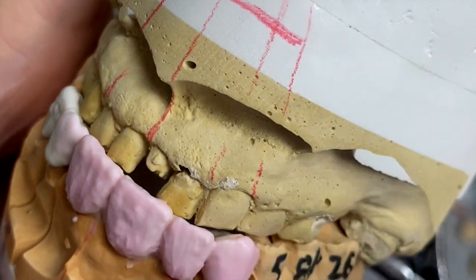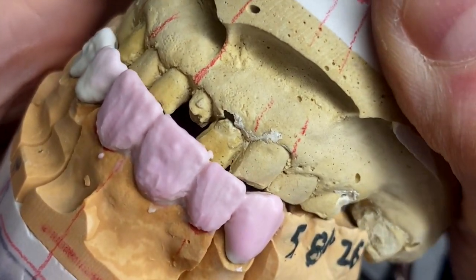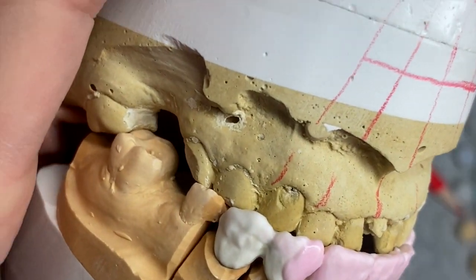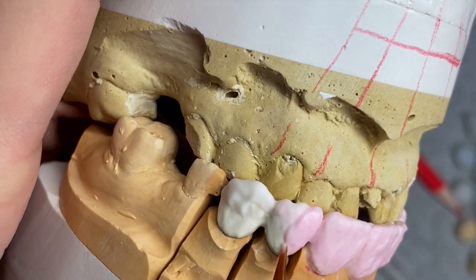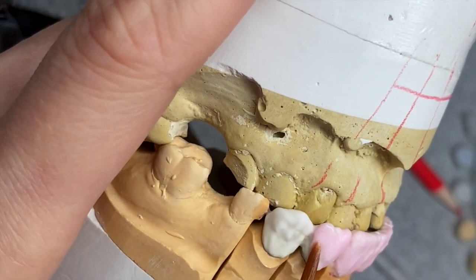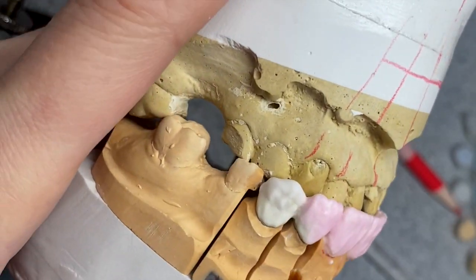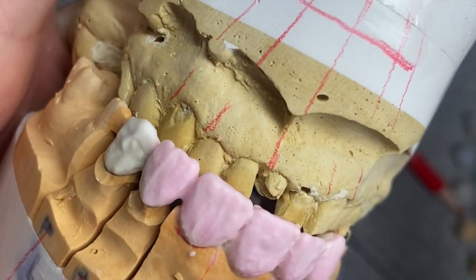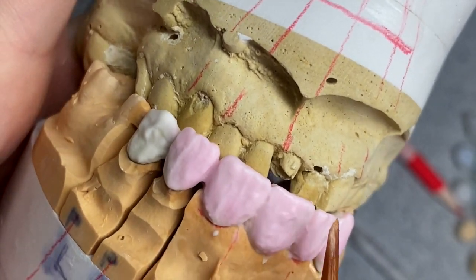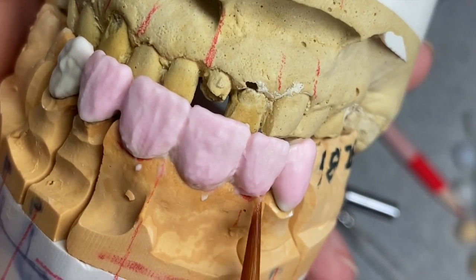We're also going to have to provide canine guidance — always do the lateral movement. That's very important. A six-unit bridge is not only in the mouth for aesthetics; it has to do its function. The person has to be able to bite their food with it, and the canines are supposed to guide the whole mouth. If you are able to provide that, then your work will be good and functional.